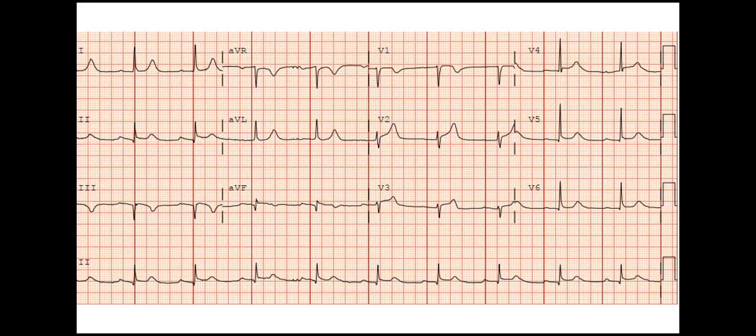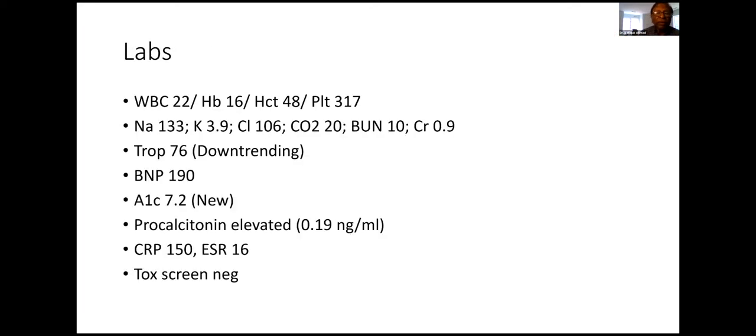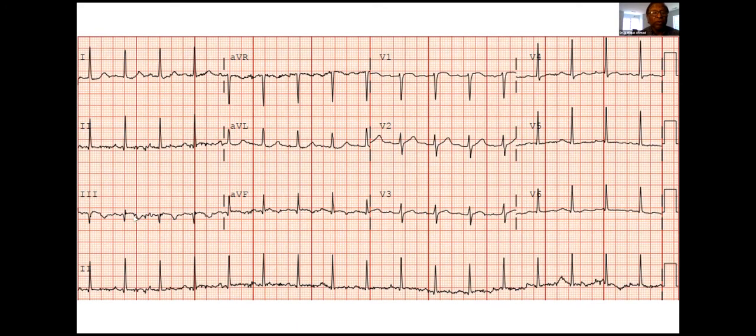Yeah. Okay. There is ST elevation in lead aVF, slightly downsloping, but in lead 3 also in aVF. Very subtle. And there is a Q wave, so somebody is developing an infarct. Even though your attendee didn't think so, I think that was 2:1, and then it goes into complete heart block with narrow QRS.